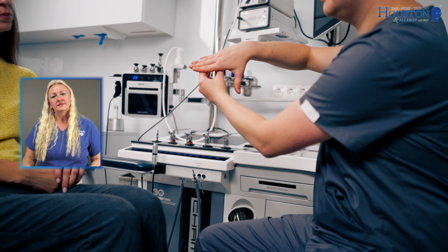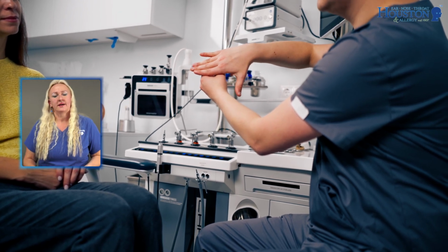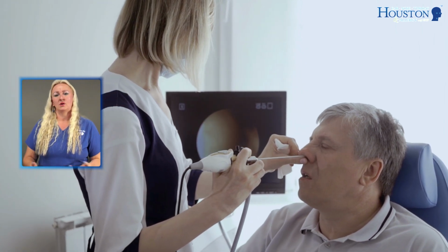When we are ready to do the procedure, I will have you comfortably sitting in my exam chair. I have it set up so that you and I both can see what's happening inside of the nose. I know sometimes patients are very scared and think it's going to be a very painful procedure, but don't be worried. I use a flexible tip camera to maneuver throughout the structures in your nose so you don't feel any pain. As a matter of fact, for most patients, I don't even have to numb the nose for this procedure, unless you are very swollen and then I would not be able to see anything. But we'll first look together.